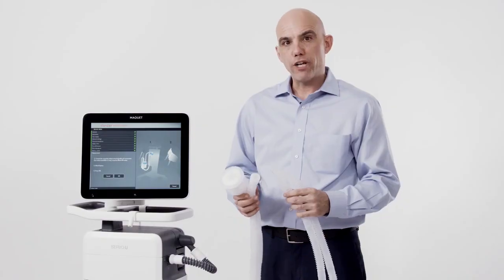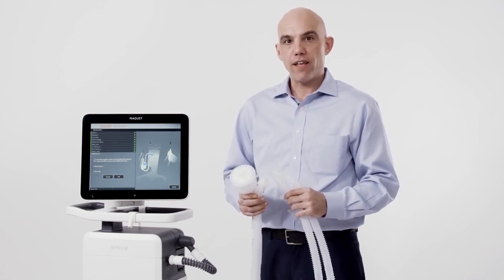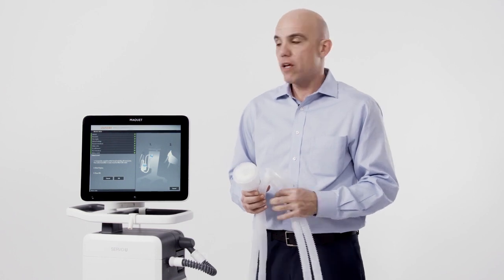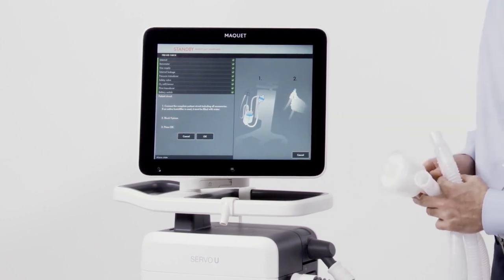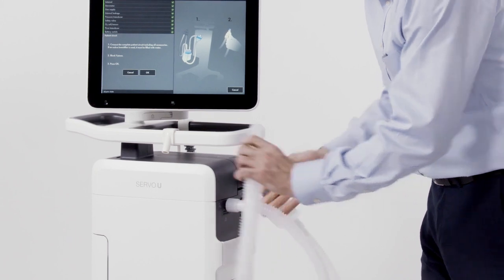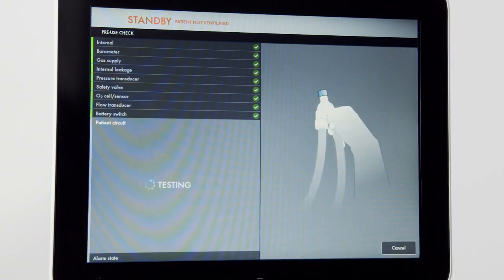The final step of the pre-use check is the circuit test. It's important to use the circuit, filters, and any accessories that you plan to utilize with the patient. If an active humidification system is going to be used, assure the humidifier is set to off and the chamber is full of water. Note on the screen step one — step two is to occlude the circuit. Once the circuit is connected and occluded, confirm on the screen and follow the on-screen prompts.